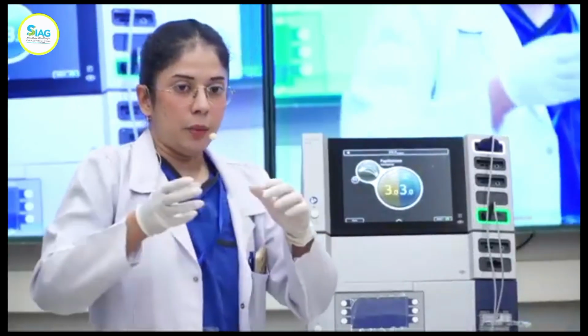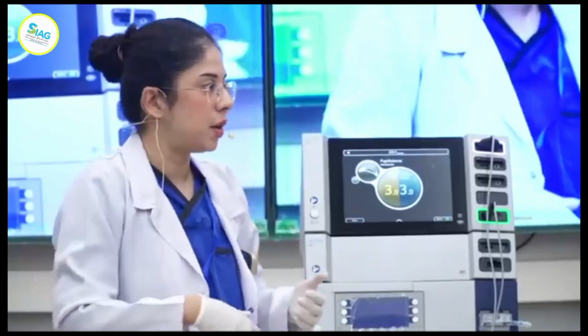And that's actually very good when you're doing, for example, maybe POEMs and tunneling. But again, you have to know the utility of each. You can use it safely, but you just have to be familiar with it. So what we can do is everybody can have a try at this in between. They don't have to have it now, and we can just even start the hands-on.